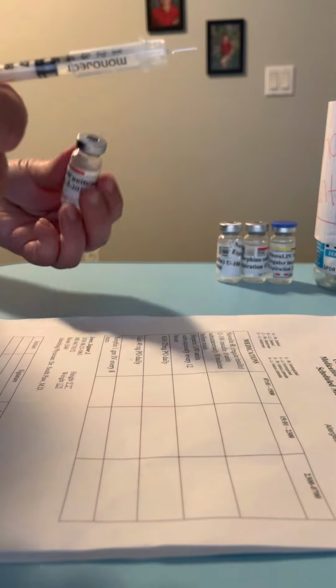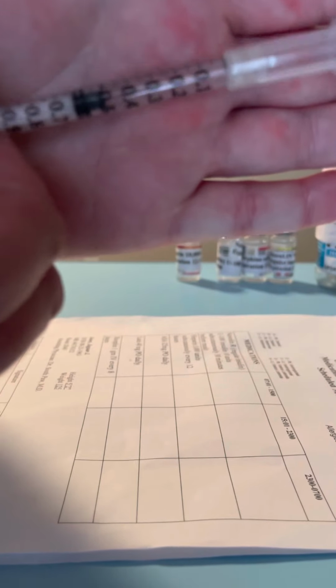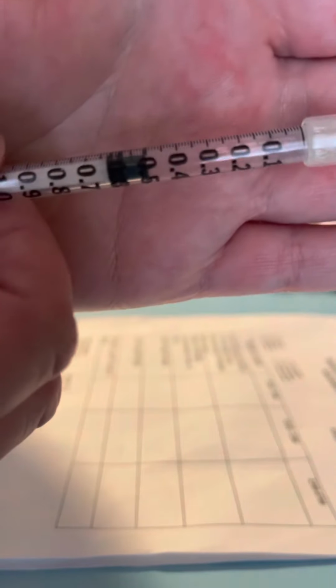Okay. Pull my safety up so I have 0.5. There we go. 0.5 milliliters.